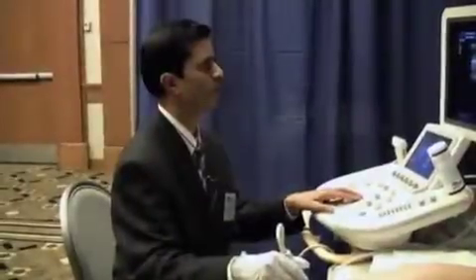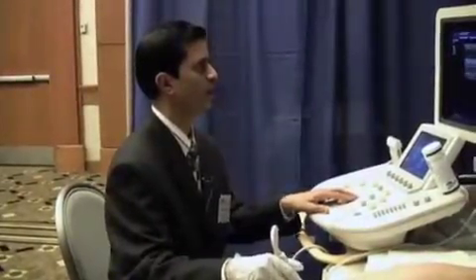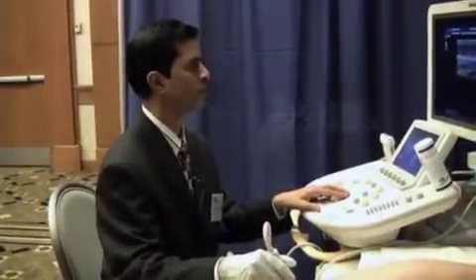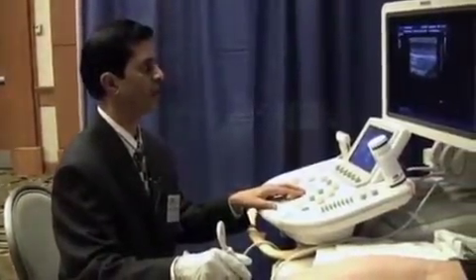This is Nandkumar. I'm from Thomas Jefferson University. We'll be looking today at musculoskeletal ultrasound and specifically the ultrasound of the ankle.